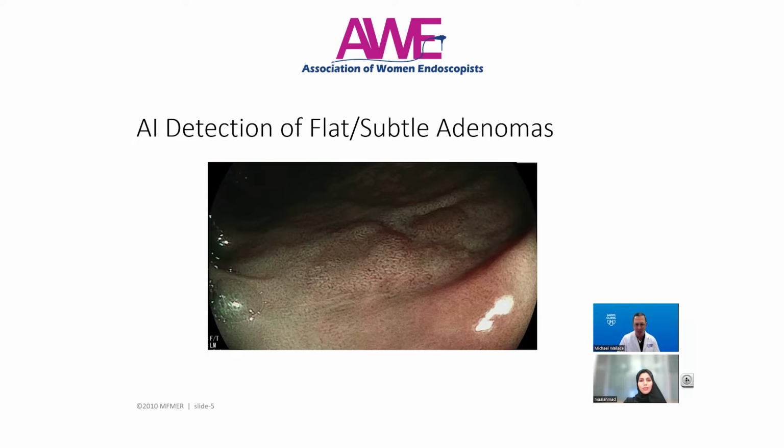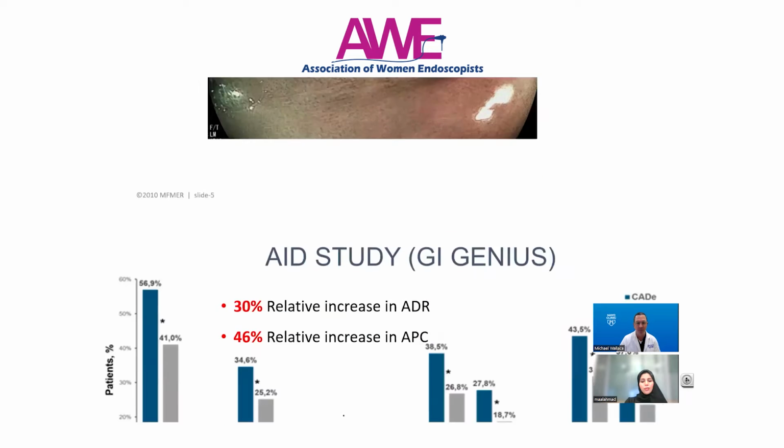And it detected this polyp and flagged it. And this is a polyp some people would agree we could certainly miss. Some of the polyps are very obvious and don't necessarily need any supplemental systems. And that's true whether you're just using NBI or blue light or an AI system. But some of the polyps are hard to see. And we'll show some of the data that this technology may improve our ability to detect polyps that we otherwise wouldn't see, or alternatively avoid missing polyps that we might otherwise miss.